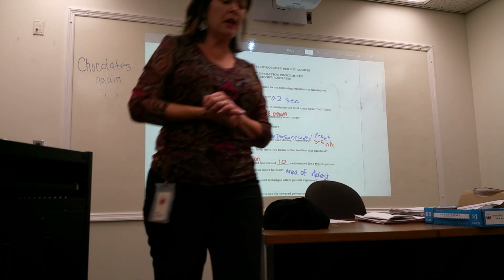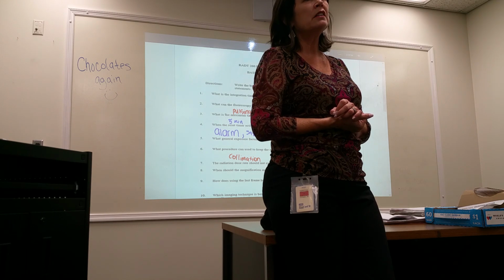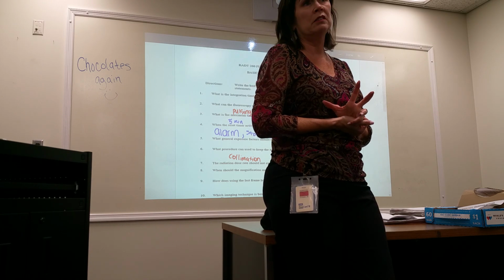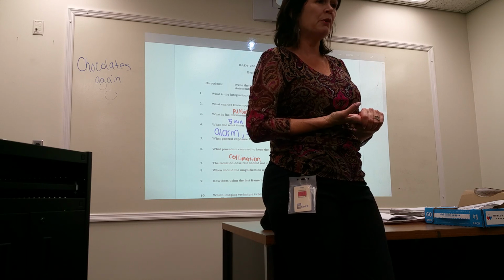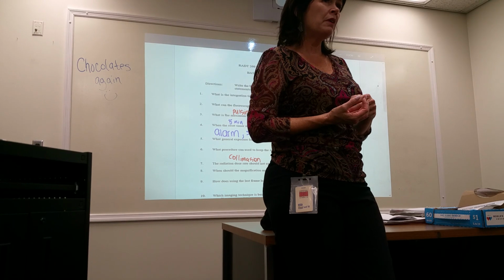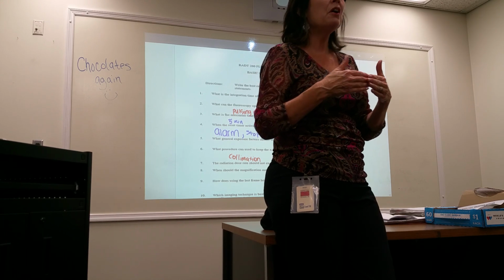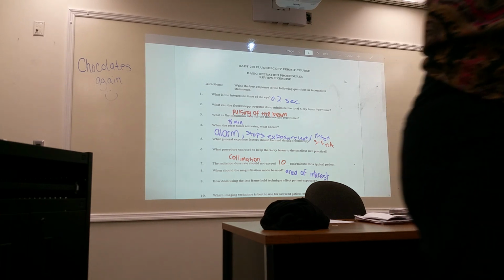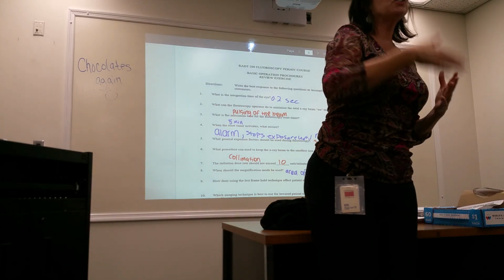So the maximum at the tabletop: the fluoro beam should not exceed 10 R per minute if the automatic exposure control is on. Now if the AEC is off, it can't exceed 5 R per minute. Basically the regulators are stating that if the AEC is on, we trust the machine to do what it's supposed to do, so we allow 10 R per minute. If it's up to us as operators, they don't trust us so much, and they keep it down to 5 R per minute. But we're going to do a demonstration towards the end of this class.